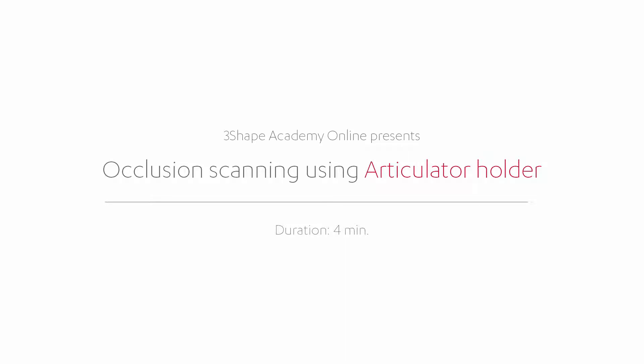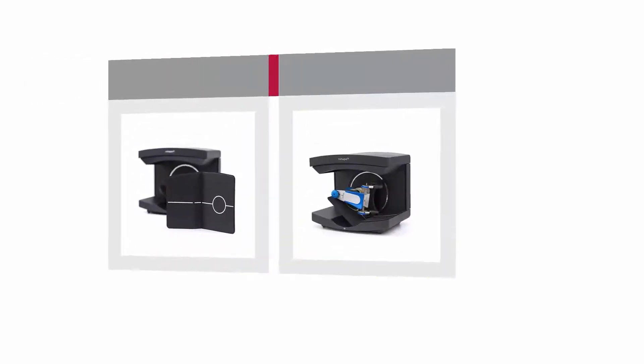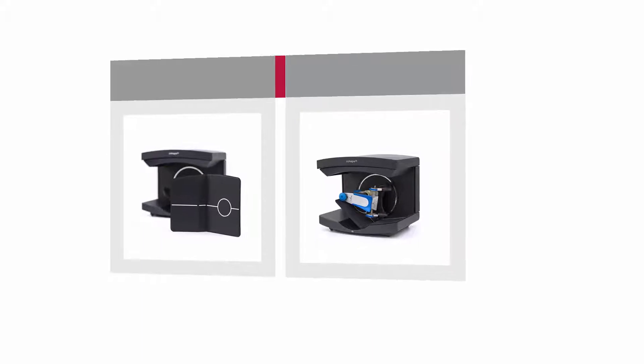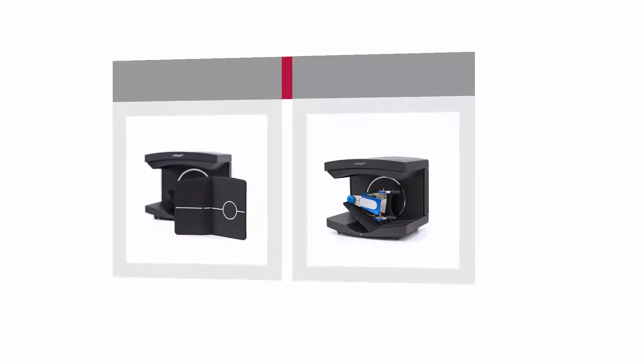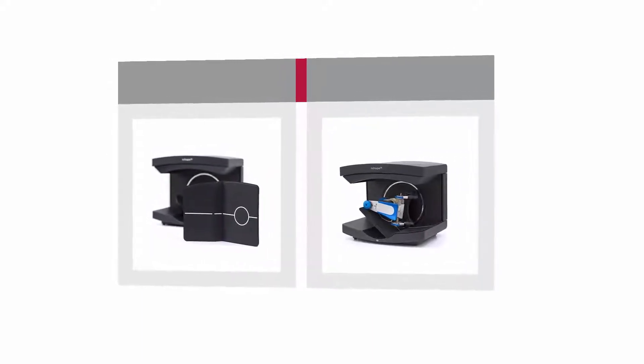This video will show you how to perform an occlusion scan of the models using the Articulator Holder. Use the Articulator Holder to perform an occlusion scan of the models fixed in the Articulator, and this video will present the exact workflow.